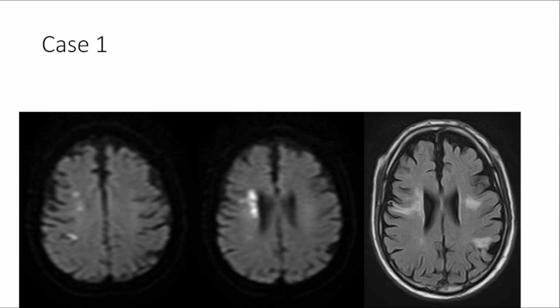The best part of working in the US is that we as neurologists never spared our radiologists, and our radiologists never spared us. We keep coming to each other. What do you think is going on? Because it's mutual learning. Okay? So, this is a watershed stroke.